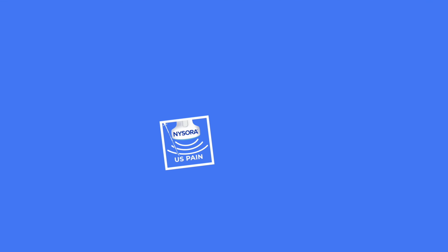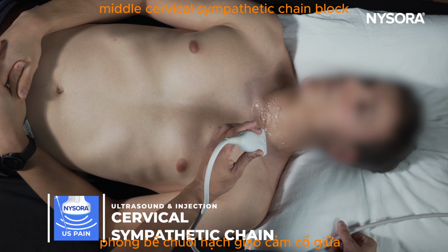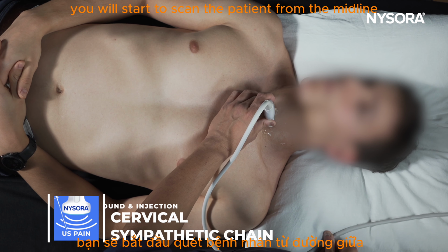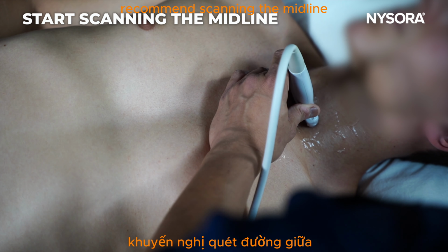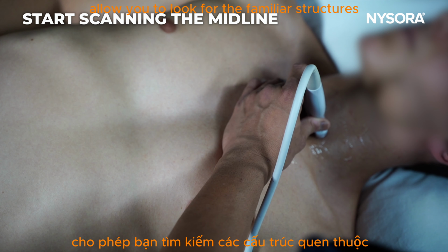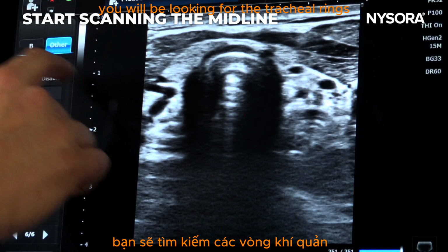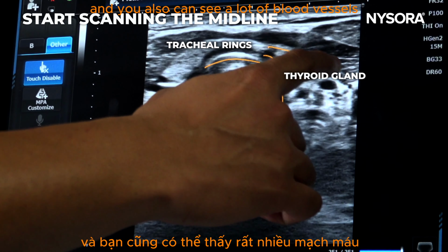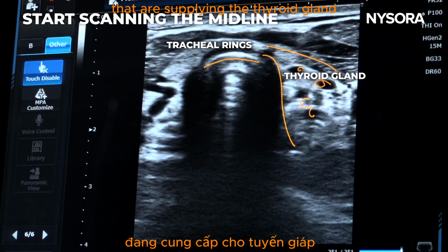Thank you. I'm going to show you how to do an ultrasound-guided middle cervical sympathetic chain block. To perform this block, you will start to scan the patient from the midline, and I always recommend scanning the midline because it will allow you to look for the familiar structures. So here on this image, you will be looking for the tracheal rings, and then you have the thyroid gland, and you also can see a lot of blood vessels that are supplying the thyroid gland.